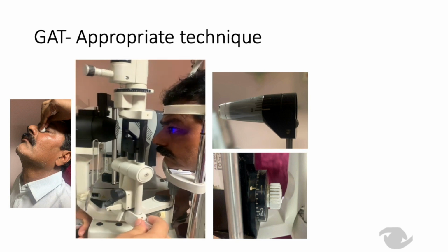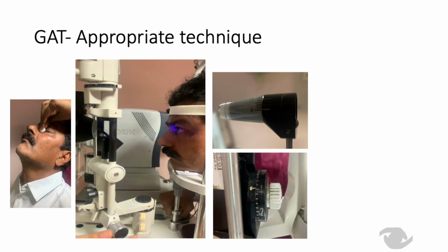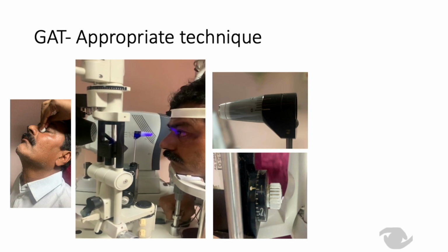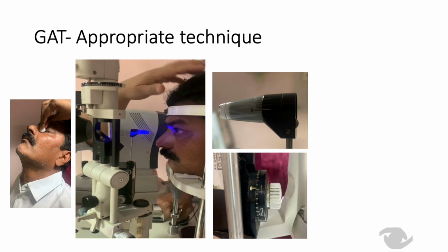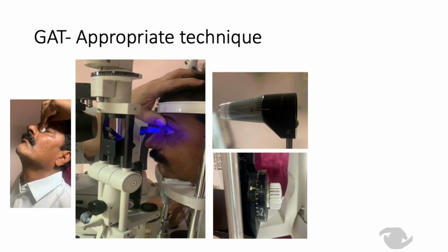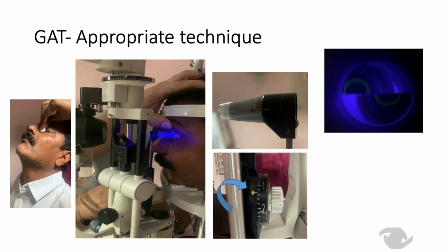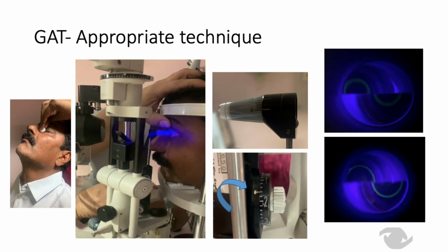With the slit lamp arm at an angle for optimal illumination with the cobalt blue light source at maximum brightness, the patient is asked to keep both eyes open and look straight ahead. The upper lid is lifted gently and the slit lamp moved forward to see the perilimbal blue hue. Then, looking through the left ocular, the joystick is gently moved ahead so that the prism head just touches the center of cornea and two semicircular mires are seen. The tension knob is rotated till the inner edges of mires touch each other. The reading on the dial multiplied by 10 is the estimated IOP.